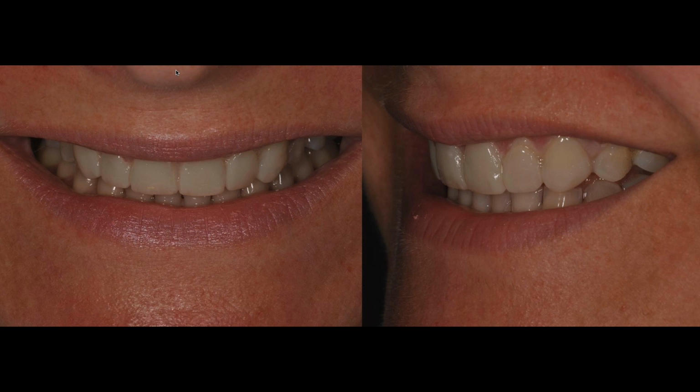Because we're going to have to add either composite or ceramic to achieve this kind of result in our patients. At the same time, you can see in the lateral photo that some of the wax was added to the gingival portion of the teeth. Now the patient will understand why she needs a crown lengthening procedure or just plastic surgery of the gingival tissue, to give us better contours on the teeth that we are going to restore, so that we can end up with a better, aesthetic result.